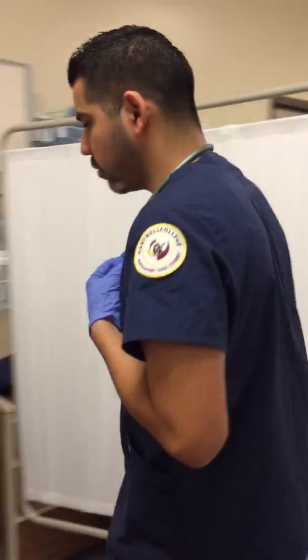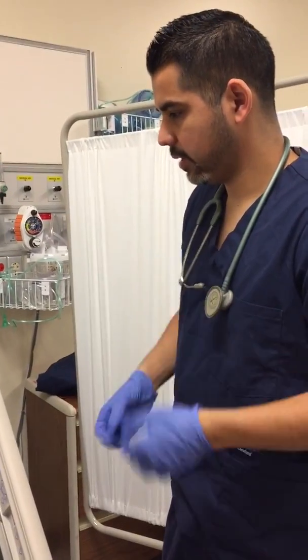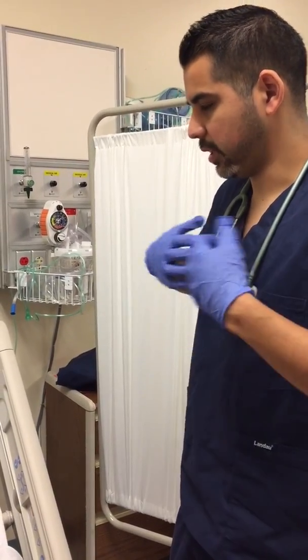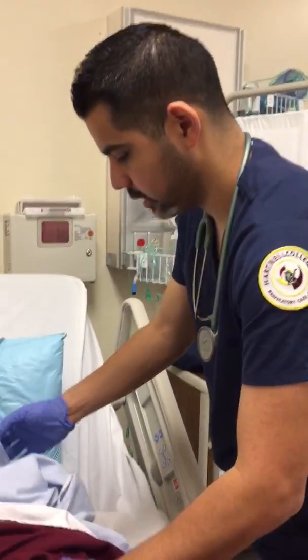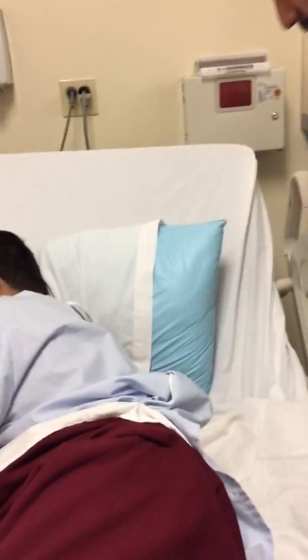Okay, now I'm going to be listening to some breath sounds, okay? I'm going to be listening to the back first, and then I'm going to listen to the front, all right? Then I'm going to listen to the sides, and then I'm going to go up, okay? Bases to top. All right, so if I go ahead and kind of push it to the side. Thank you very much. Okay.